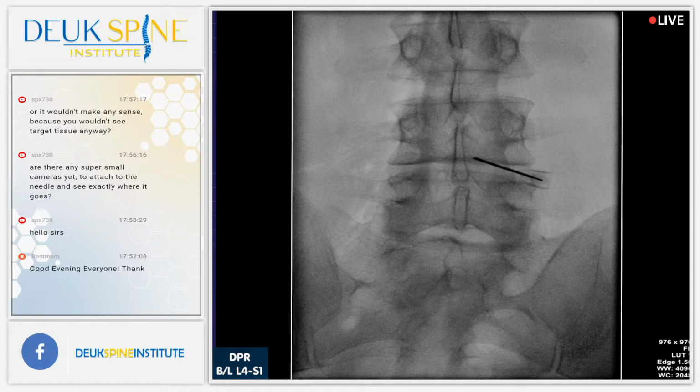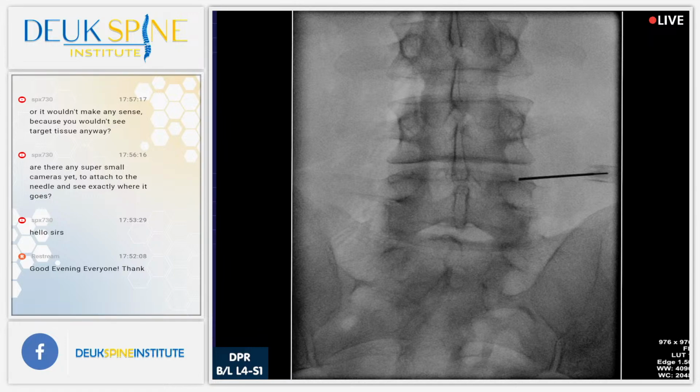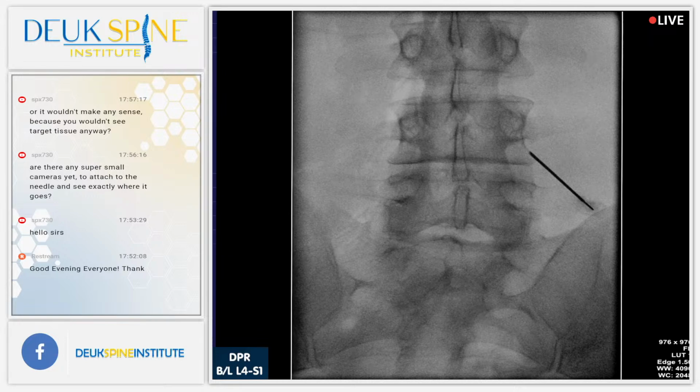Well, I feel now that's fine. Yeah, no, I'm wondering about these. Legs, yeah, they're okay. Give me some num-num. Well, this is where actually we... Let me just do a little bit of num-num. I would just use your finger going forward to find the midline, because the x-ray can be wrong quite often. Remember, x-ray is a 2-dimensional representation of something that's 3-dimensional.